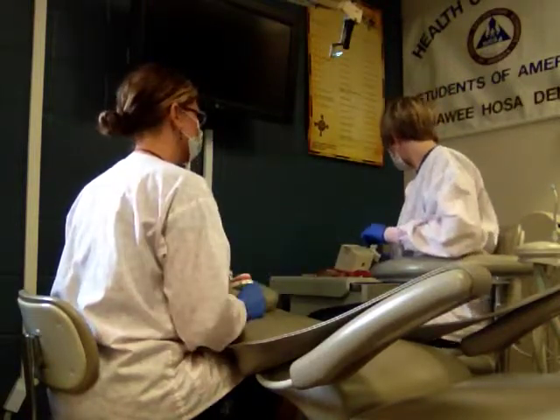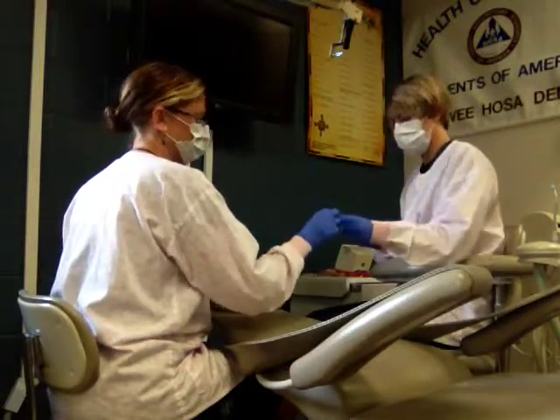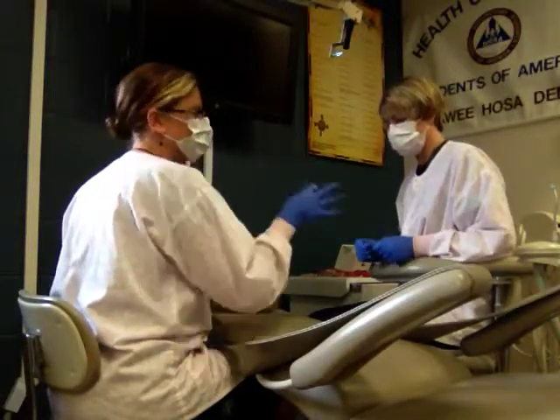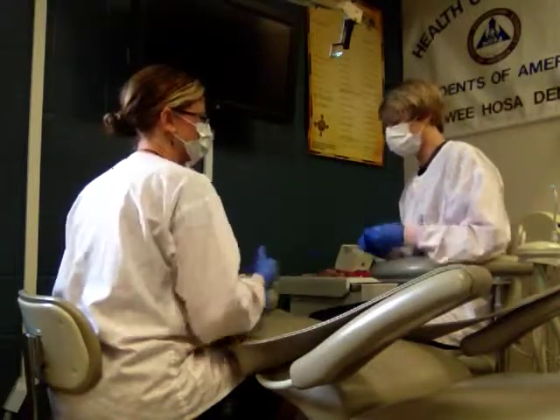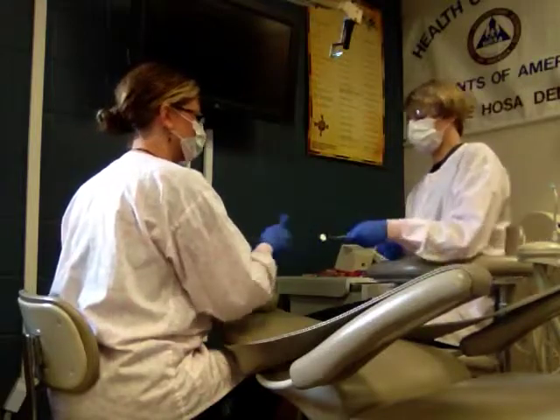When we're all done, we're going to use the slow-speed handpiece with the sandpaper discs on it and go through the series of that to smooth and polish. The whole time you're going to be using the HVE suction. Then we'll do a final rinse, and that is composite number three for skills.